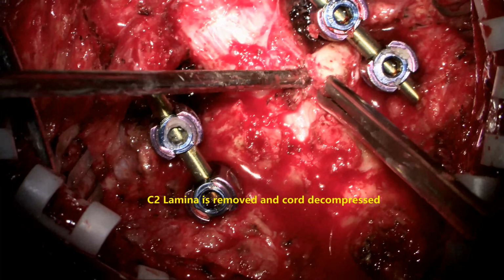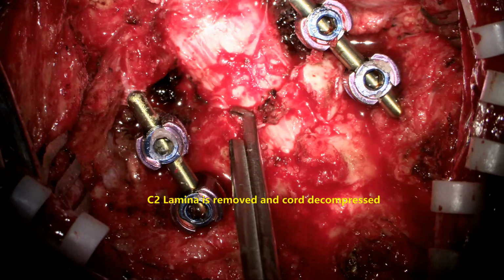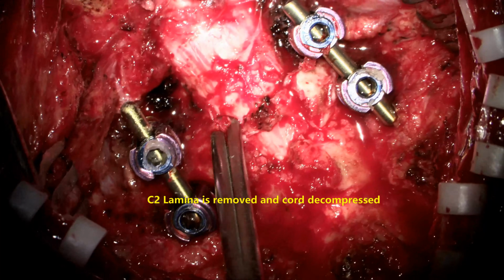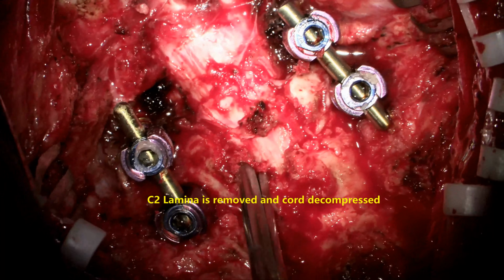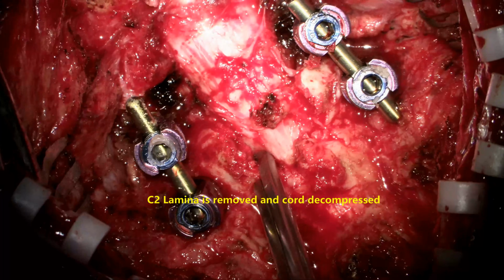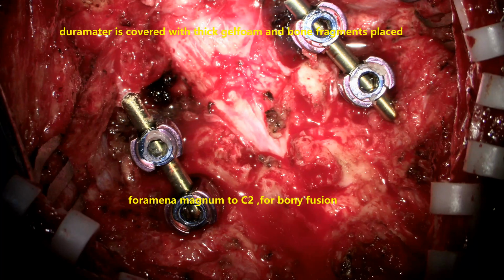Now you can see the mobility of C2 has reduced and the lamina is taken out, and the C2 dura mater and the cord are decompressed, because the MRI shows still significant pressure on the C2. Now the bone is taken out.